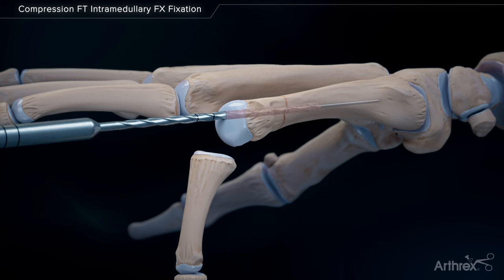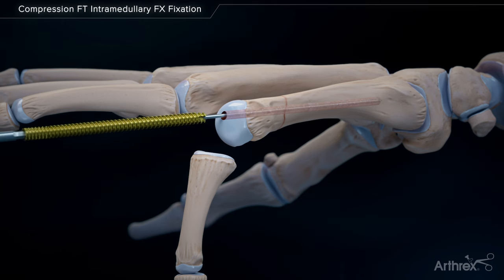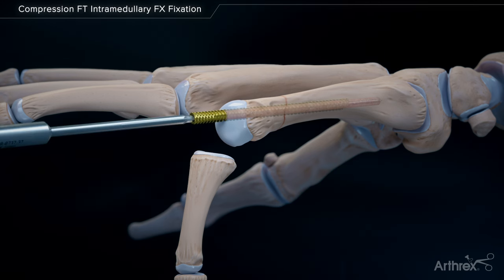A cannulated drill over-drills the guide wire and the wire remains in the bone. The cannulated screw is placed over the wire, obtaining fixation across the fracture site.